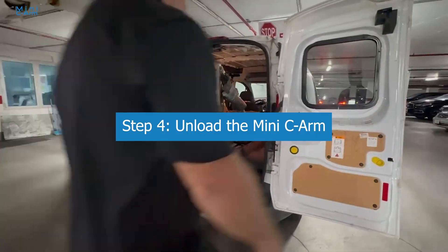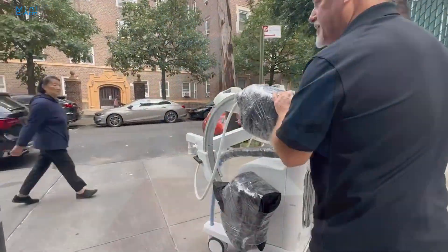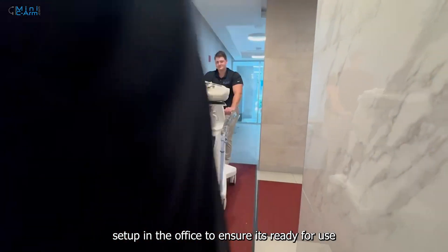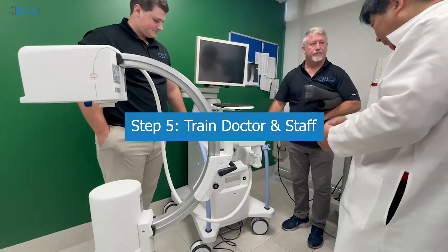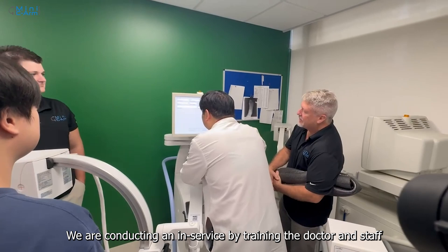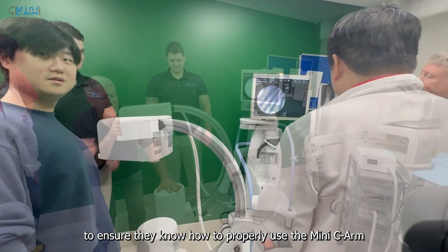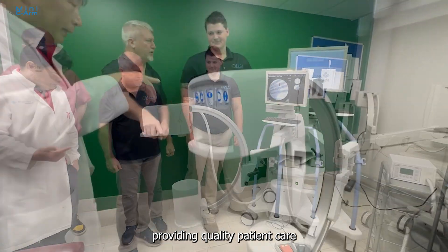We are bringing the MiniCArm into the building and getting it set up in the office to ensure that it's ready for use. We are conducting an in-service by training the doctor and staff to ensure they know how to properly use the MiniCArm, so they can focus on what matters most — providing quality patient care.